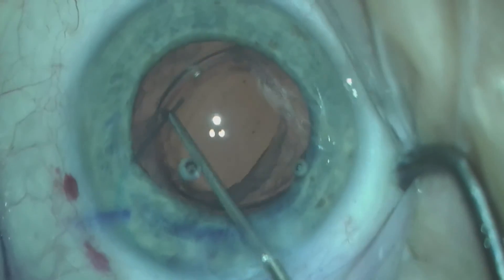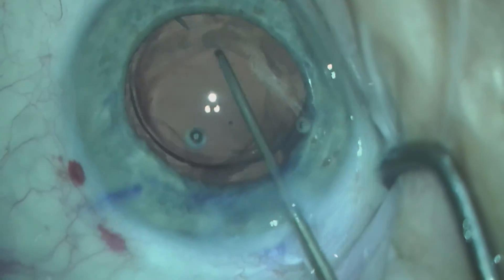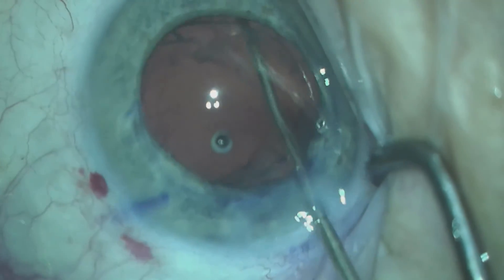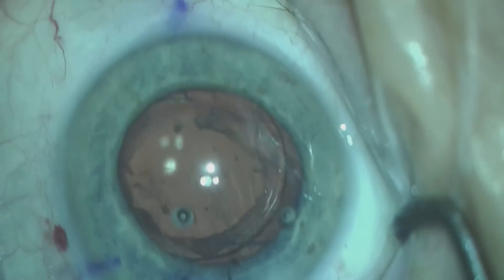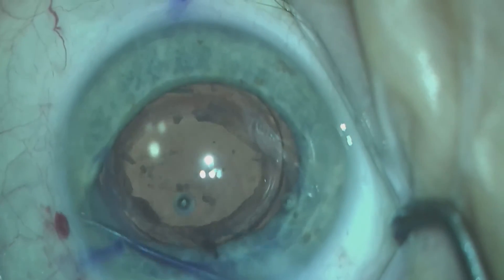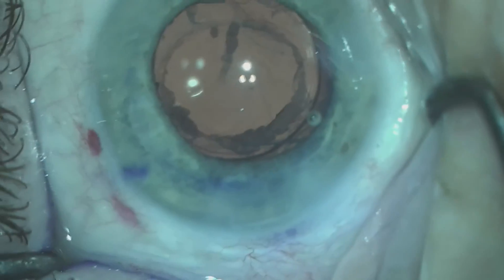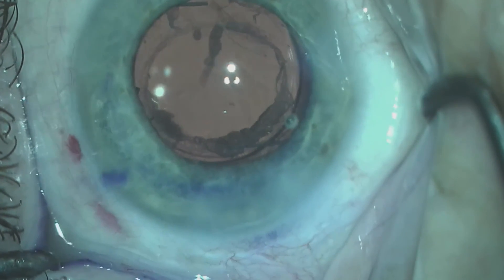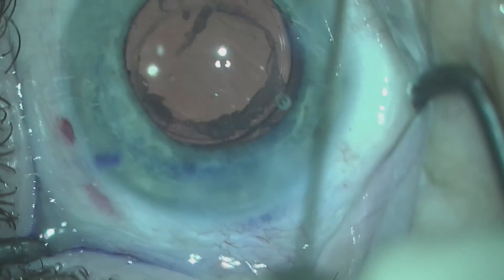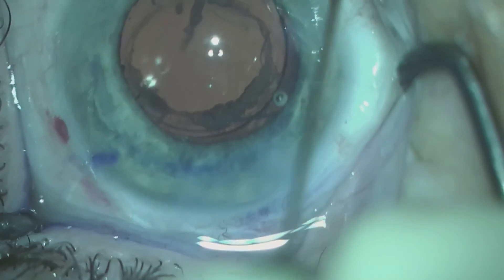I'm using a Bausch & Lomb LI-61AO lens, which is a three-piece lens. The decision was made to put the lens in the sulcus because of the zonular laxity. We did perform optic capture, with the lens captured in the anterior capsulorhexis that was made from the initial cataract surgery. At this point, I'm using an iris manipulator to ensure that the lens is properly seated in the sulcus and there is no remaining haptic or cortex around. This was completed successfully and the patient did very well.